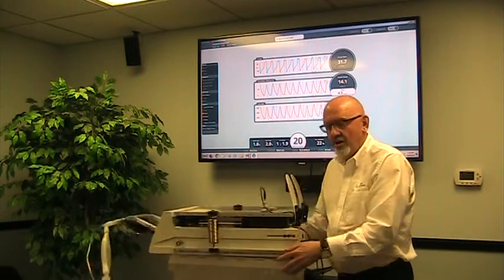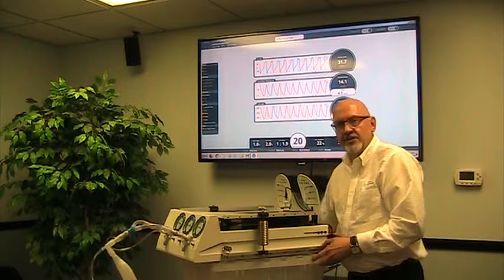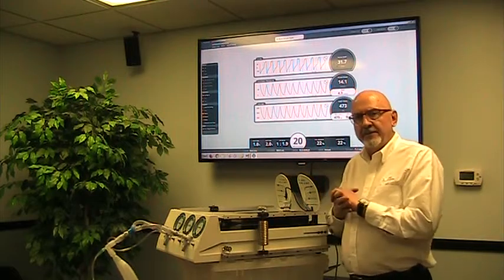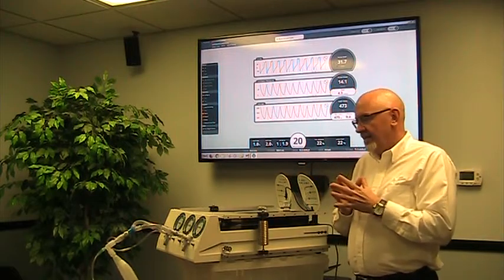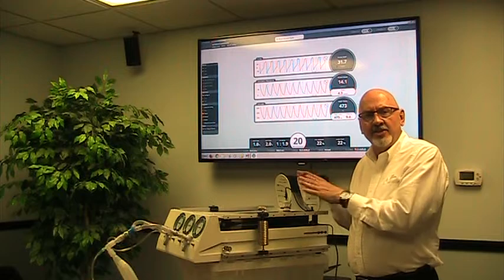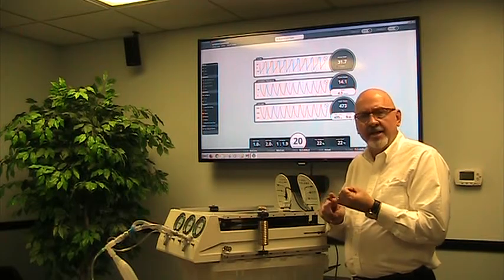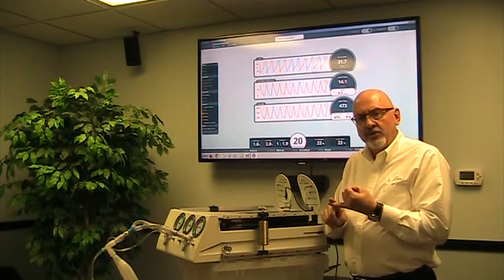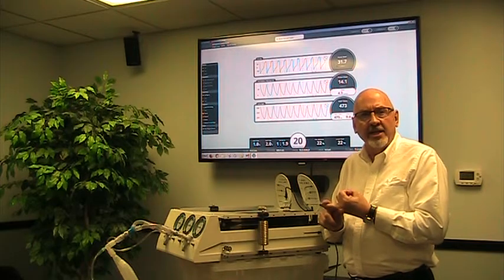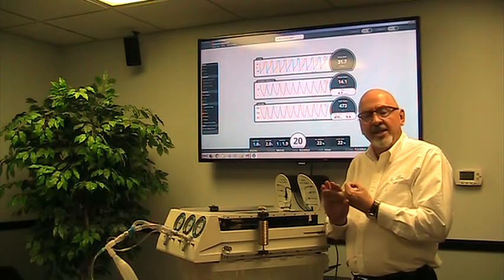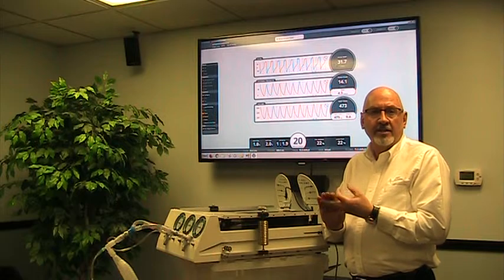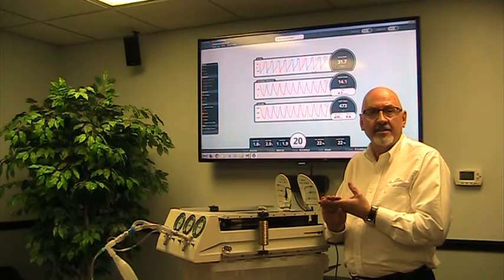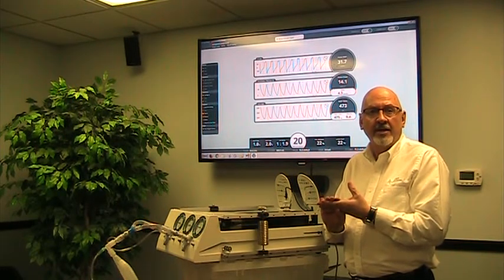Now the NuView software, just a basic overview of that, what it does is it takes this data that we're seeing at the test lung, we provide numeric values, we provide waveform displays, and we give you that in real time but you're also able to make recordings, collect data, run tests, and save all that to review it later.